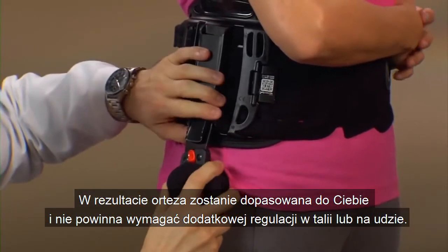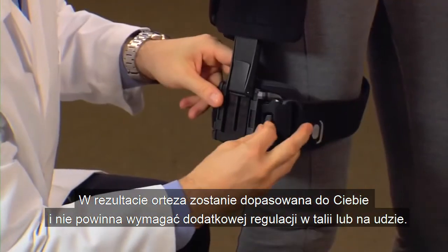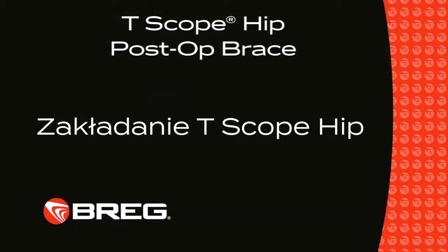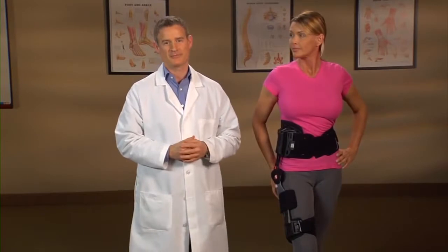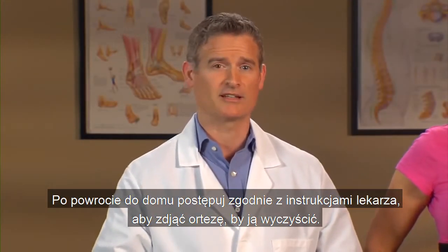As a result, the brace has been customized to fit you and should require no additional adjustment at the waist or thigh. The T-Scope hip will most likely be applied to your hip and leg following your surgery. Once you're home, follow your doctor's instructions as to when you can remove the brace to clean it.